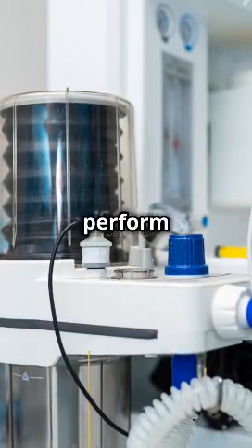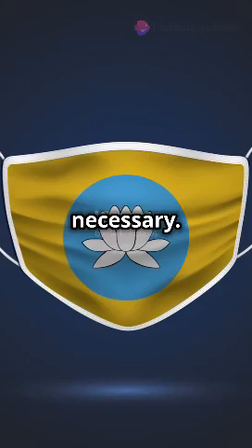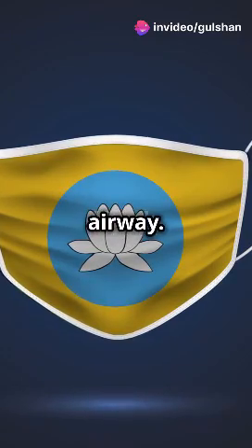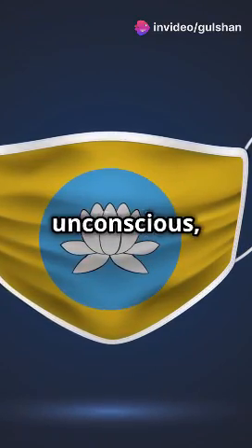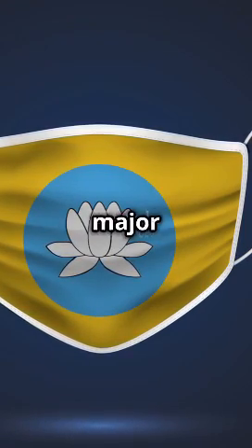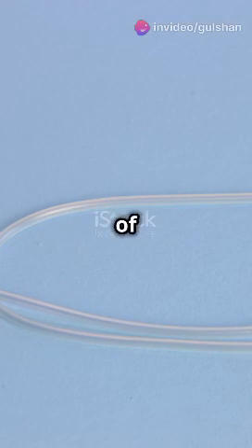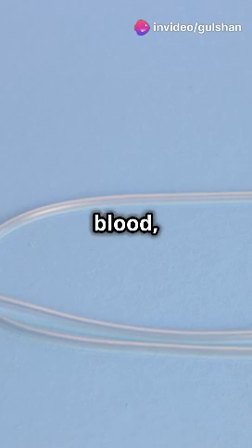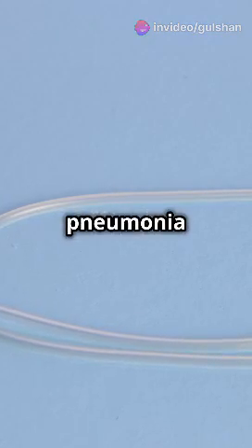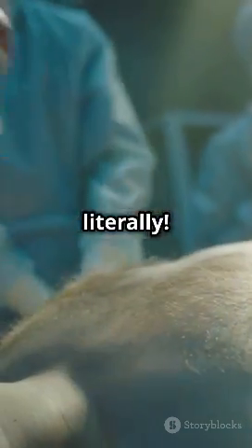So why perform intubation? There are several reasons why intubation might be necessary. It's all about protecting the lungs of patients who can't protect their own airway. This includes patients who are unconscious, have severe respiratory distress, or are undergoing major surgery, and are at risk of breathing in fluids. Aspiration of fluids such as saliva, blood, or stomach contents can lead to serious complications, including pneumonia and respiratory failure. It's a lifesaver, literally.